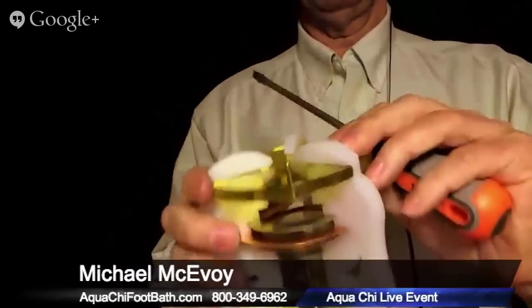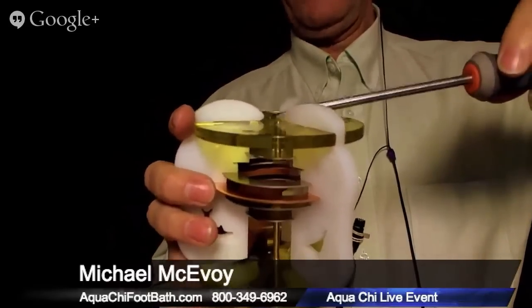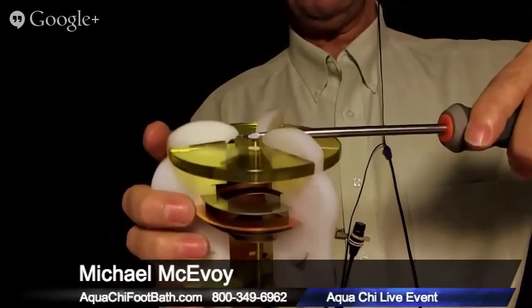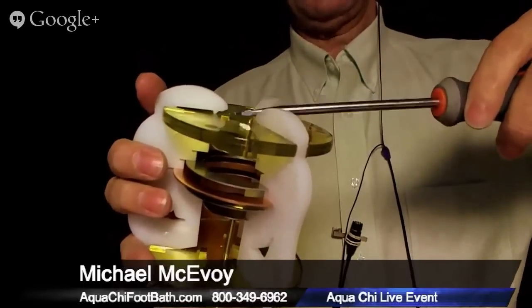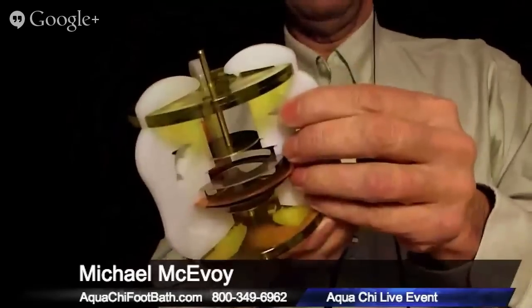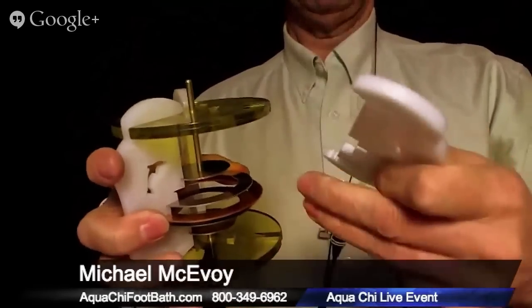We're going to flip this over. I'm wedging this flathead screwdriver and just giving a slight turn, pushing a little bit until it comes over the lip of the hole in that colored plastic. Once you've got it over both sides above the lip, you can pull out and that leg comes off.